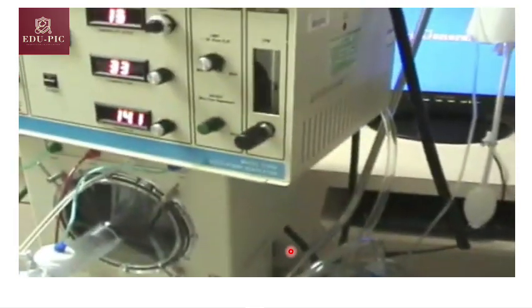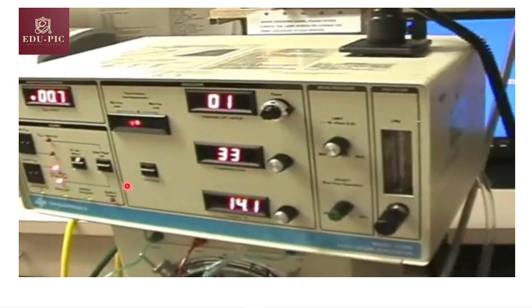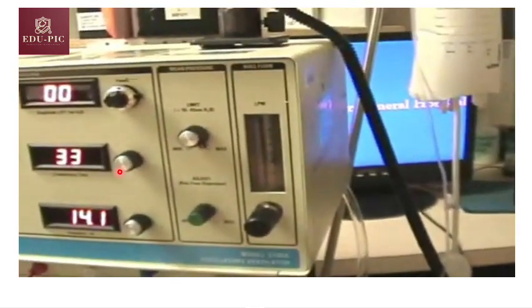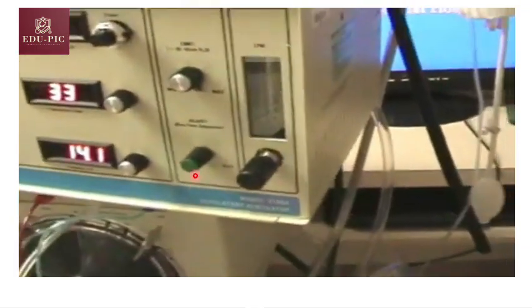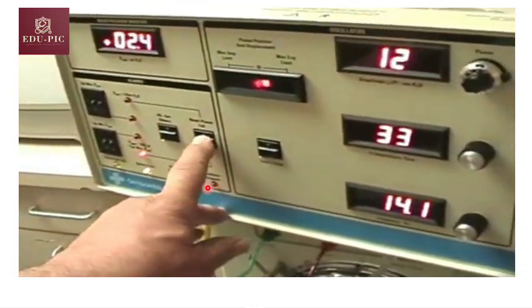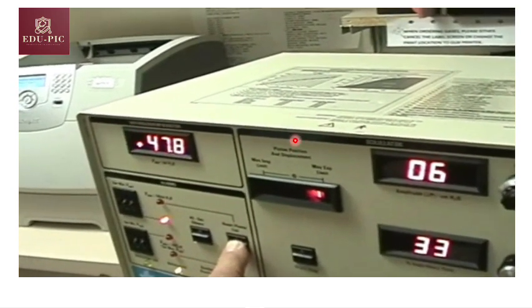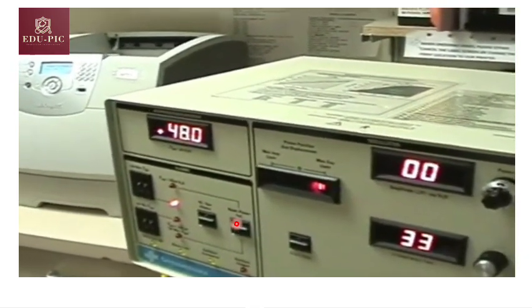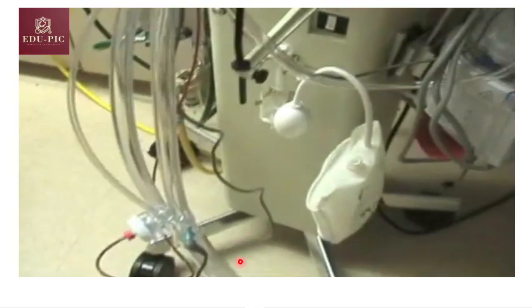And here let's see how to calibrate this machine and how to start it. Here is the on and off button. Here we started the machine to work. Here is the flow. Here is the MAP. We start with the MAP maximum, both buttons. And here is the flow, usually at 20, and we are not changing this flow. Here is the reset button. We started to press on it. Still the machine is not working, we are just calibrating now.